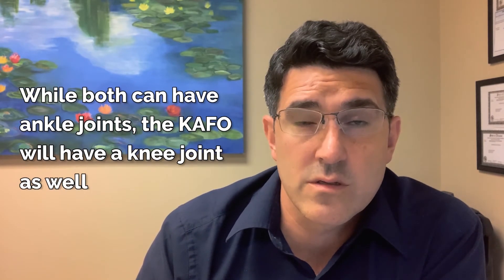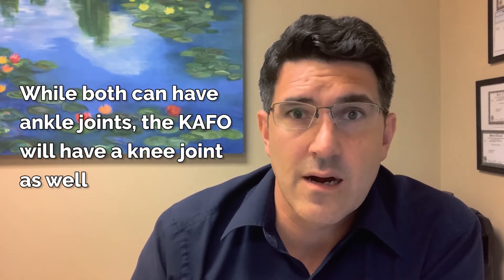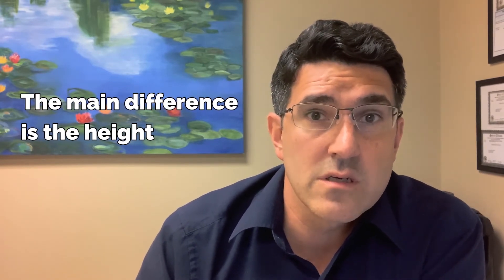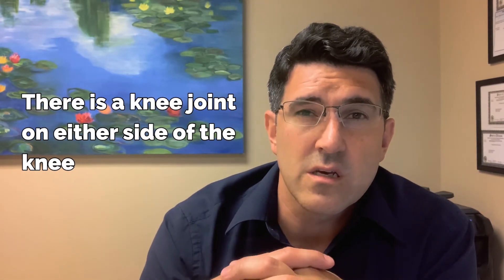That is the main difference between a K-AFO and an AFO. Both can have ankle joints. The K-AFO will have a knee joint as well, and there are many different kinds of knee joints. A drop lock is a term you might hear, among different kinds of knee joint mechanisms. The main difference is the height, and also the fact that there is a knee joint on either side of the knee to help with severe knee issues.